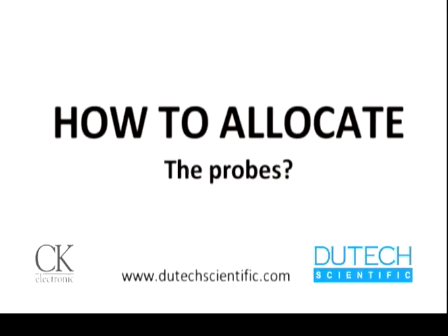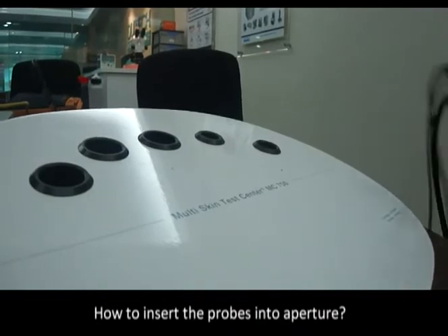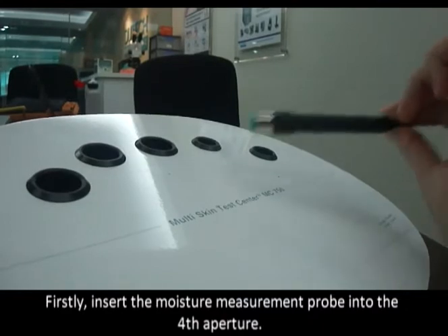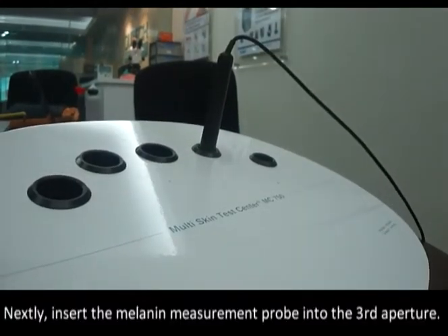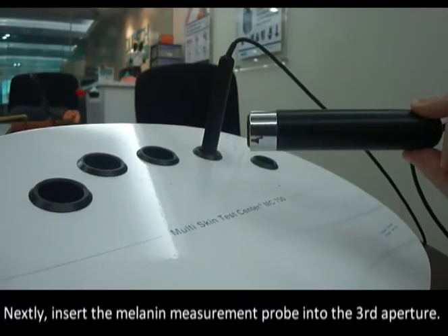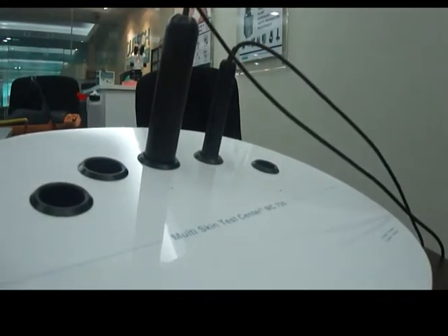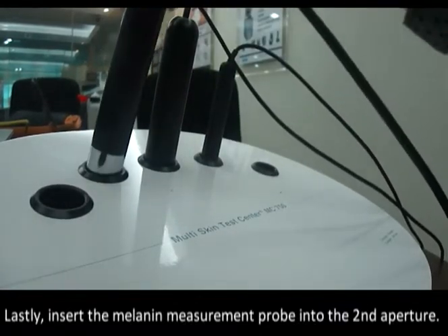How to allocate the probes and insert them into the apertures: first, insert the moisture measurement probe into the fourth aperture. Then insert the melanin measurement probe into the third aperture, and insert the remaining probe into the second aperture.